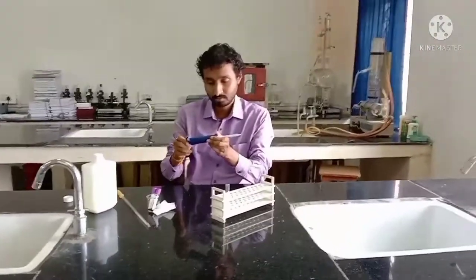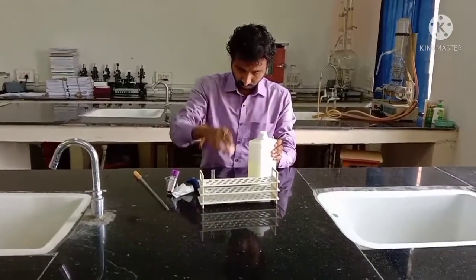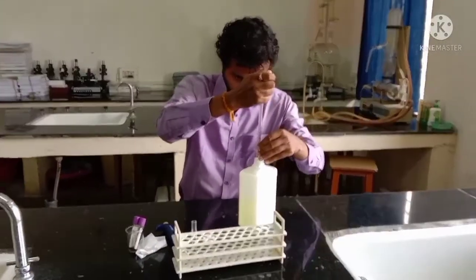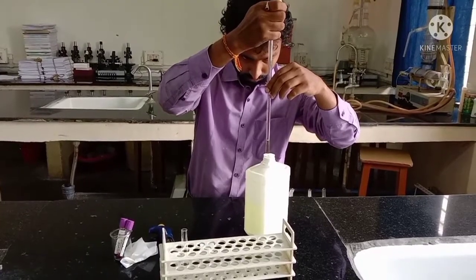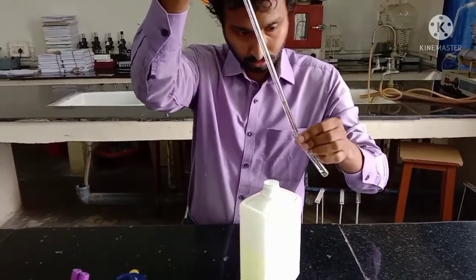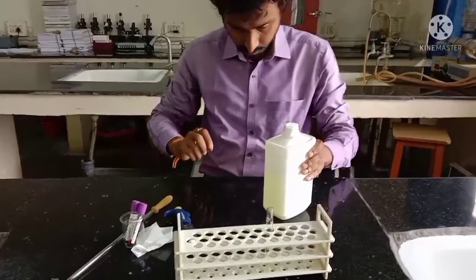Now we will see the procedure for estimation of hemoglobin by the cyanmethemoglobin method. Mr. Dhanunjoy Chakraborty, our lab technician, will perform the steps and I will describe each step. First, we take 2.5ml of Drabkin's solution using a pipette and a rubber teat — no mouth pipetting is allowed as it is dangerous for health. You can see the colour of the Drabkin's solution is slightly yellowish, different from water. 2.5ml is taken and transferred into the test tube. Step one is complete.